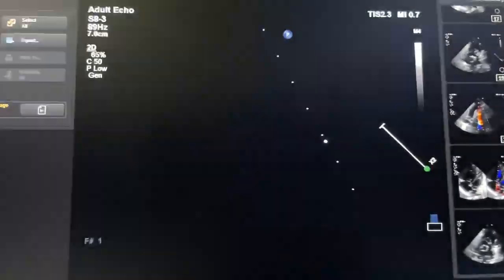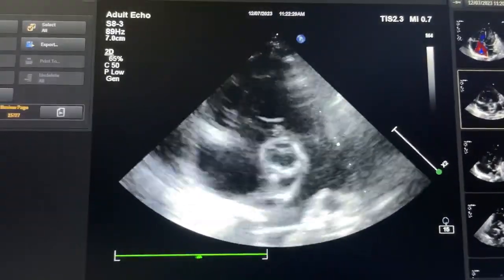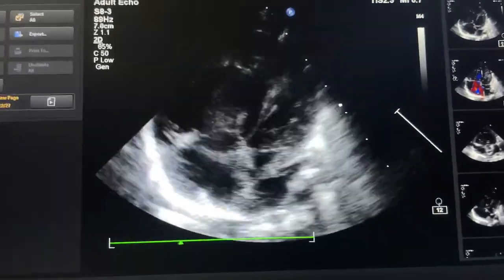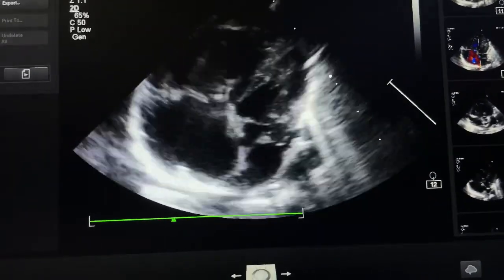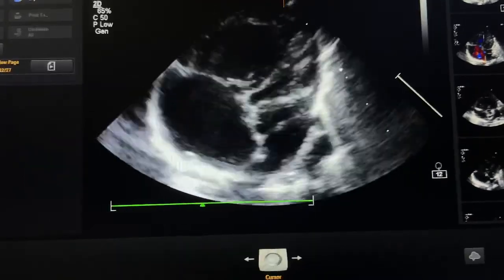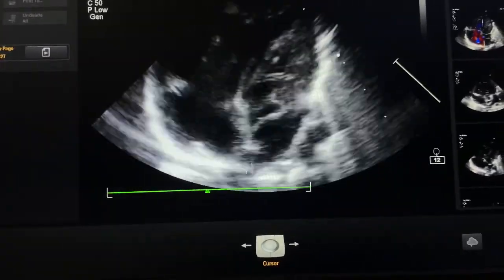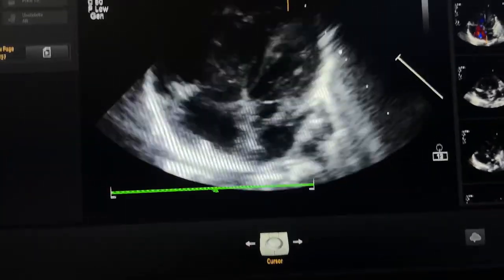So whenever you find this kind of image, a 4 chamber view, with all four chambers, you see one chamber just superior to the left atrium. Here the view is apical 4 chamber view. This is the apical portion, and the part most away from the apex is the superior one, this is the inferior one, because the apex is inferior compared to the base of the heart.